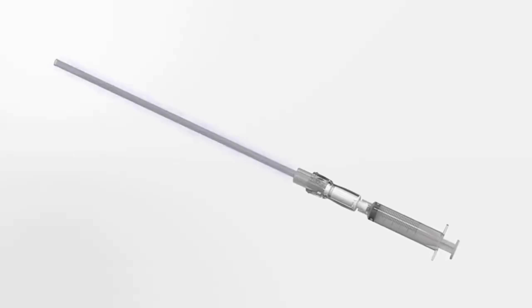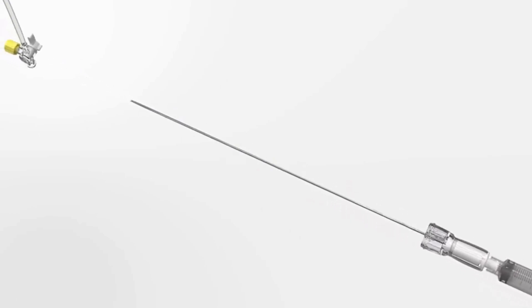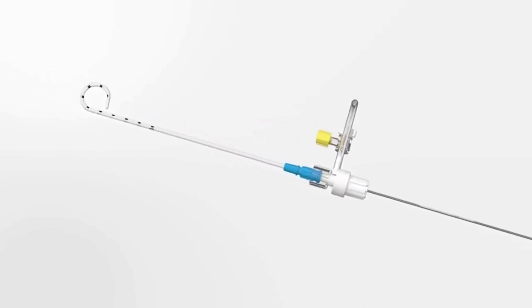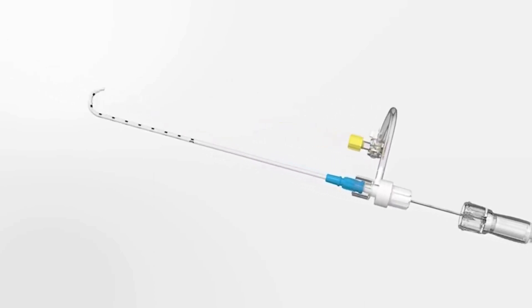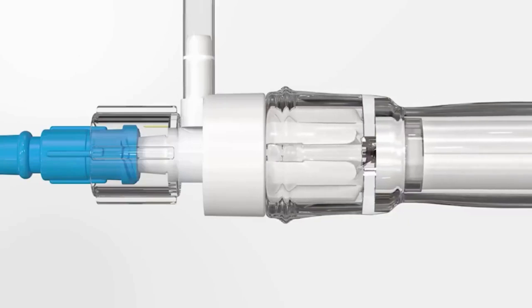Start assembly of the Safety Centesis device by removing both pieces of the protective sheath from the introducer needle. Gently load the introducer needle into the proximal end of the catheter drainage assembly. Ensure a complete engagement of the threaded valve hub and introducer needle hub to unlock the blunt obturator.